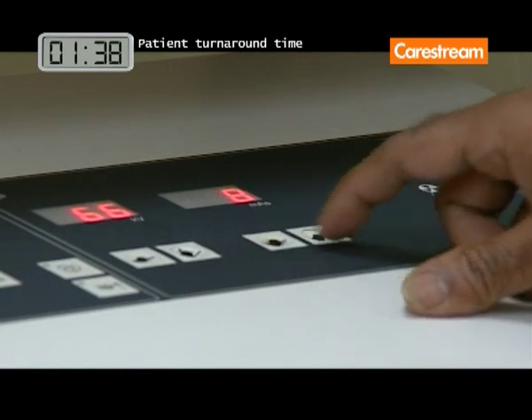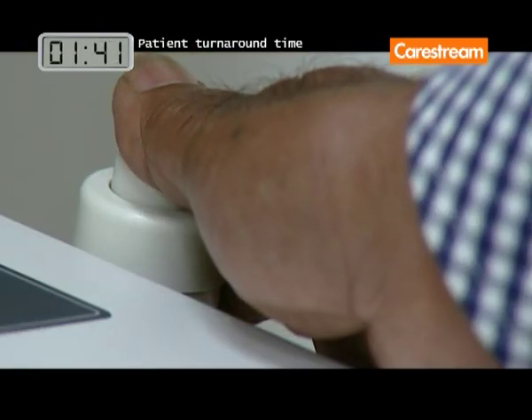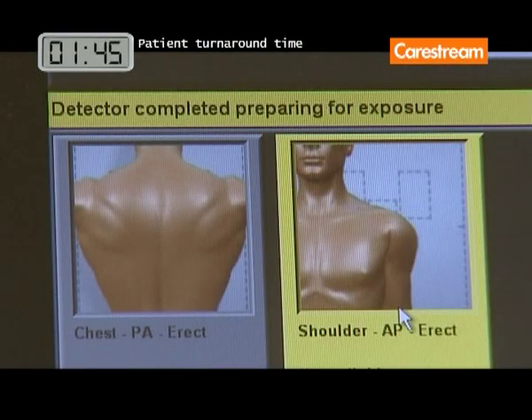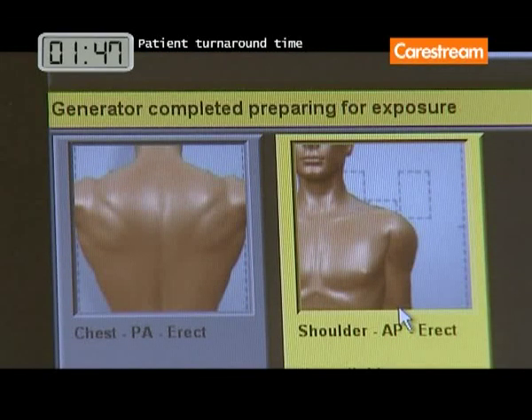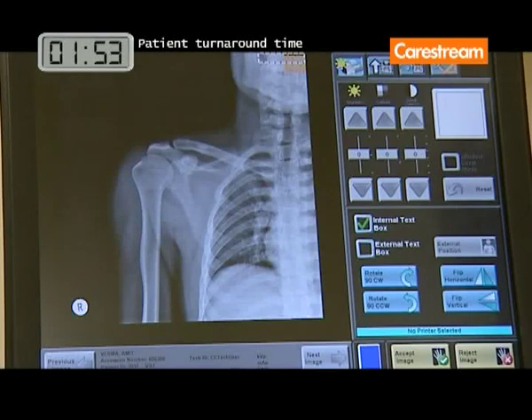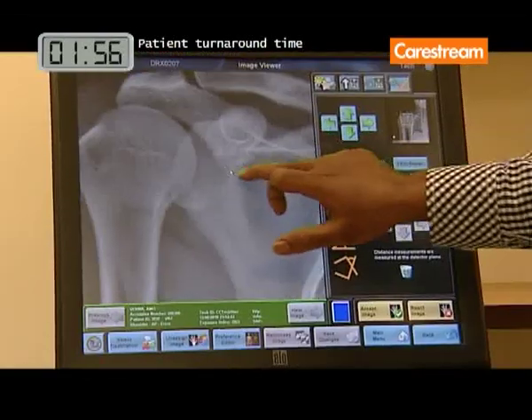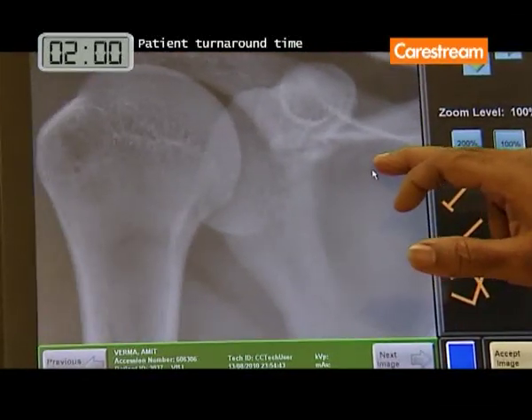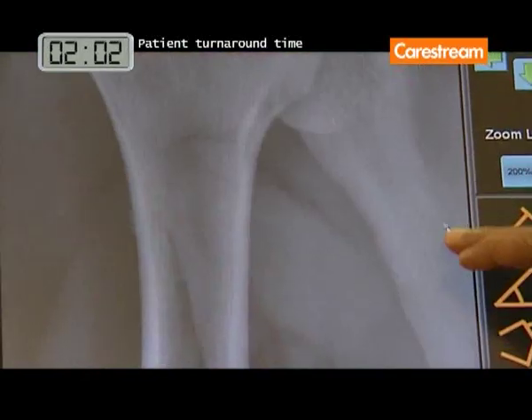The DRX-1 system can synchronize with your X-ray generator for exposure control non-invasively. Instant image availability with image preview in less than 5 seconds helps reduce exam time and recalls, improves patient satisfaction, and provides quick answers in the emergency room or trauma department.